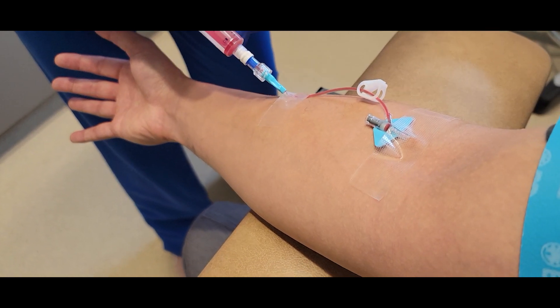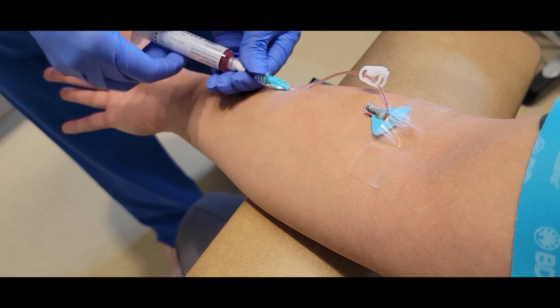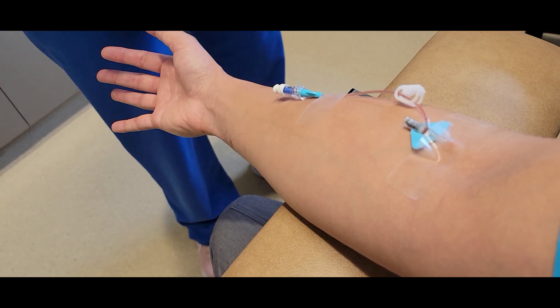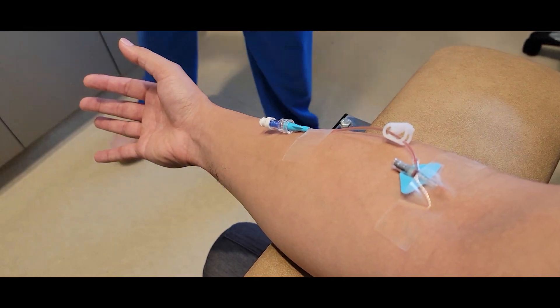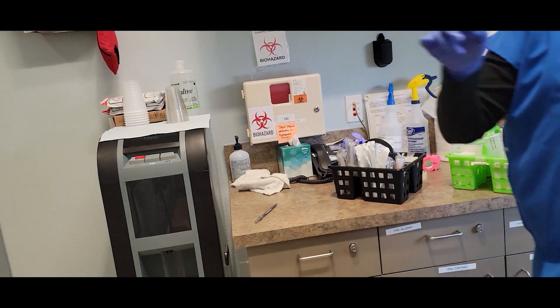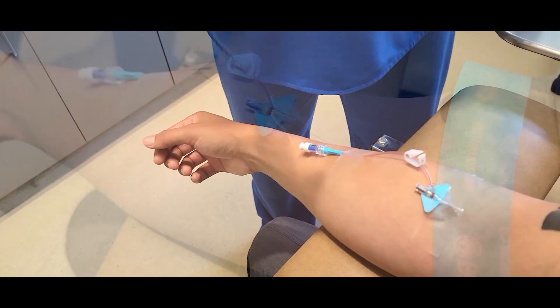And now I'm going to flush the saline into the IV, and we are good to go. And there you have it — that's how you start an IV. And of course, now you have to make sure you've thrown your needle in the sharps container and get rid of all of your trash and sanitize the area.